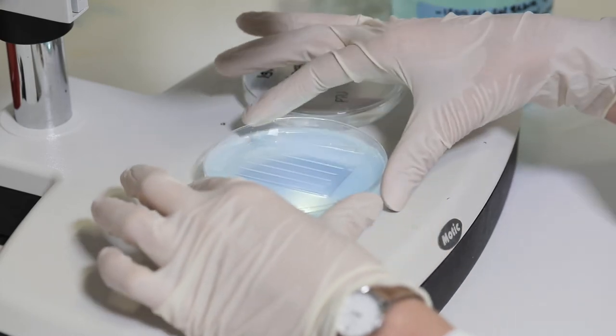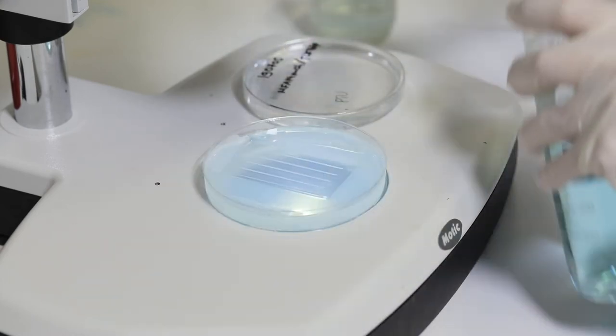When agarose becomes dense, we remove the mold and put the plate under the microscope.